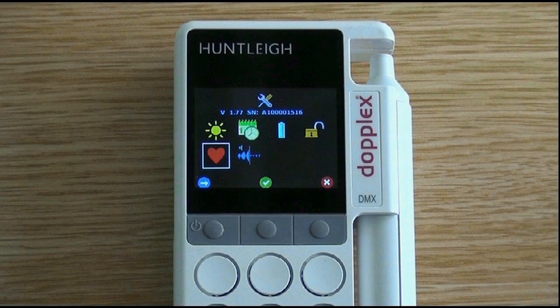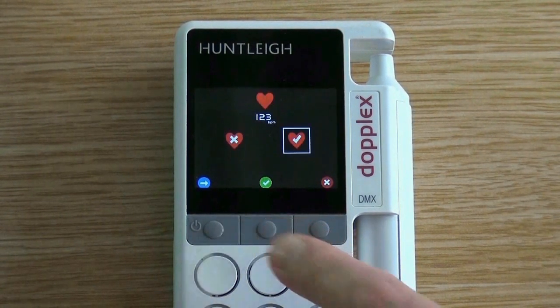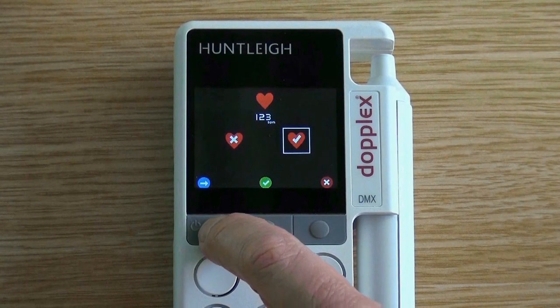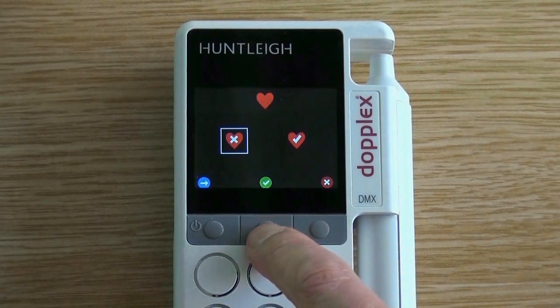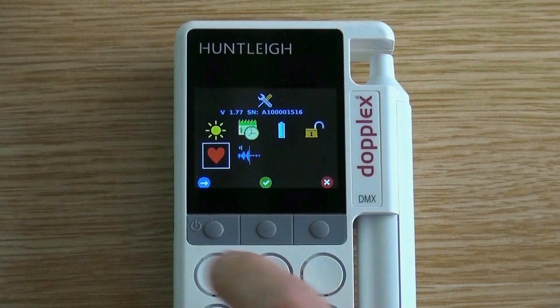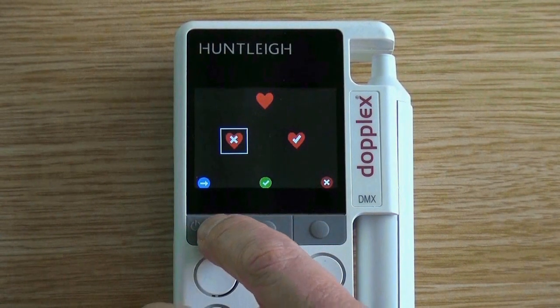Enter the setup screen by pressing the right button for three seconds. Press the left button until the heart symbol is highlighted, then press the middle button to select. Here you can see that the heart rate can be enabled or disabled. Move the box over the heart with the cross symbol and press the middle button to disable the heart rate display. To re-enable, press the middle button and select the heart with a tick.